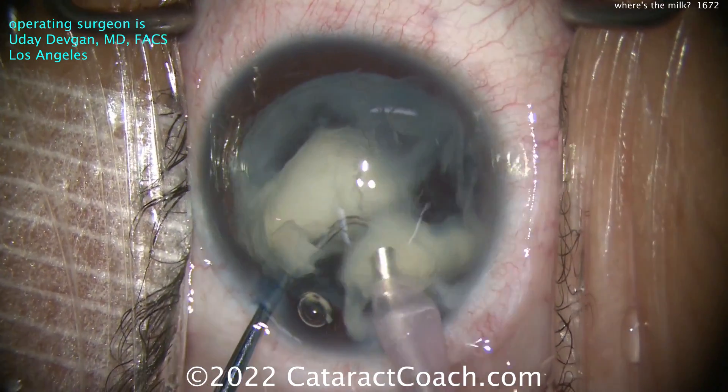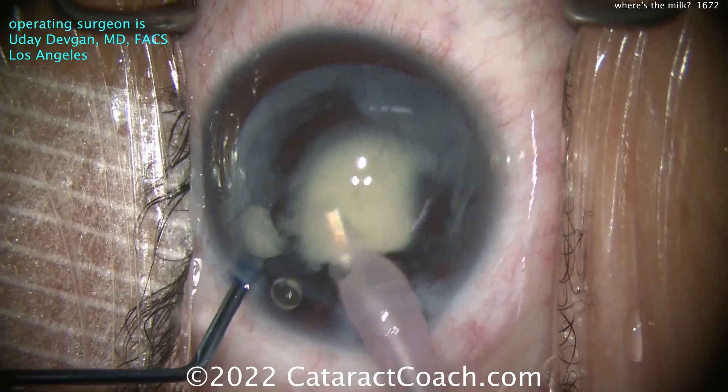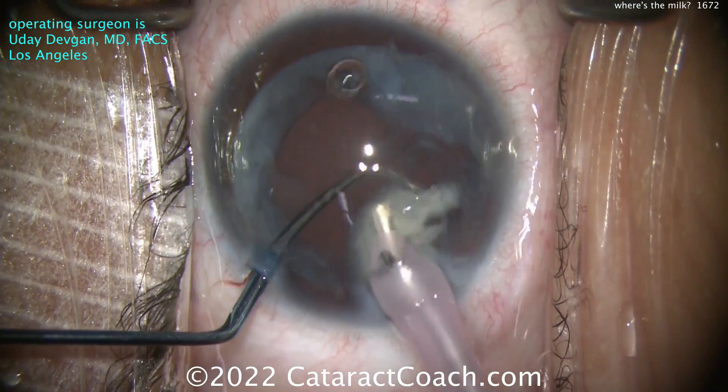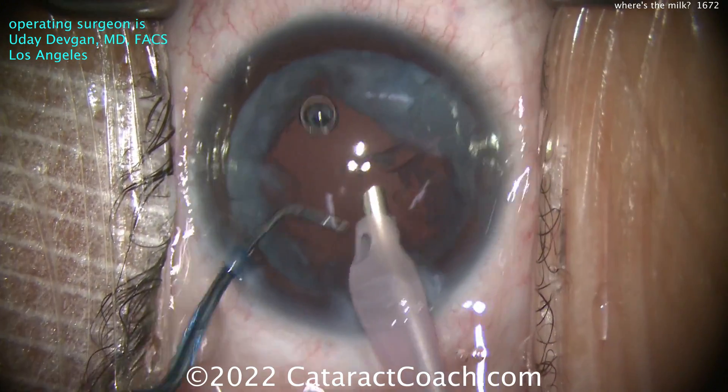Keep aspirating and getting more chops as needed, trying to stay here in the center of the eye, operating at the iris plane. I've increased my phaco power and my flow is very high - 60 cc's a minute - just so things flow pretty quickly. After that one big chop down the middle, it's all pretty easy. And look at the cortex - it really wasn't too liquefied.